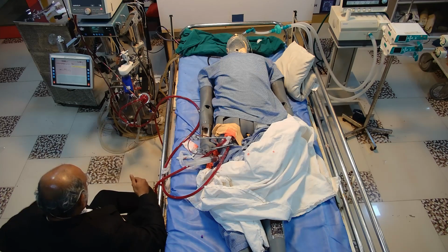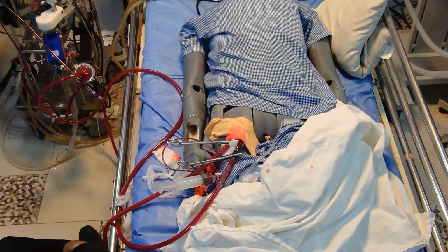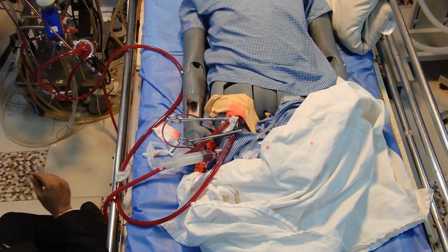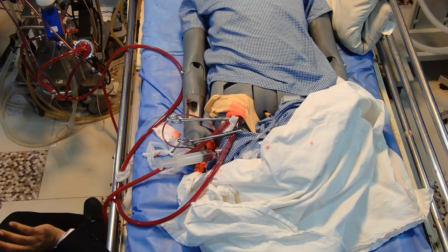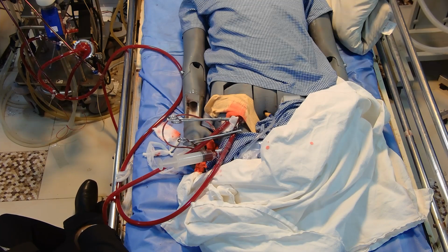So you are looking at hemodynamic parameters that are fine. You are looking at the tissue perfusion, that is by the lactate, that is fine. And you are looking at the heart at the end of 1 hour to see how the heart has tolerated this trial off. So look at the same parameters like ejection fraction, MR, VTI and TDSA. And that is where, if that is also fine, then you feel that yes, this patient is now fit for decannulation. Remember, decannulation for the VA ECMO is going to be done in the OT by the surgeon. So you have to be mindful about that.